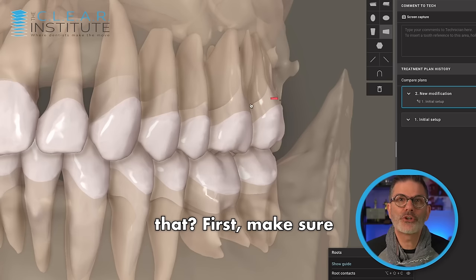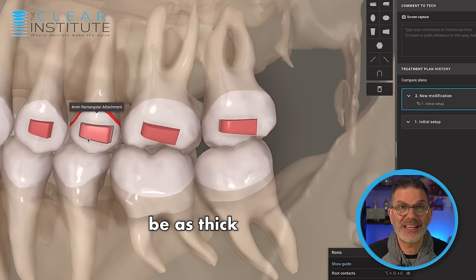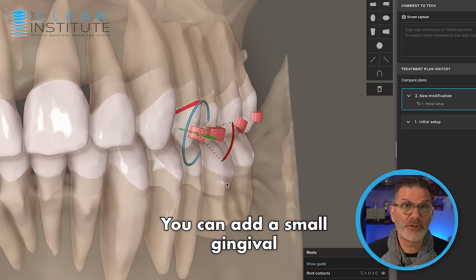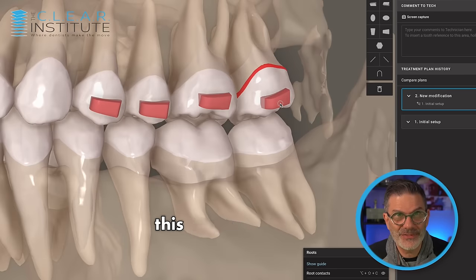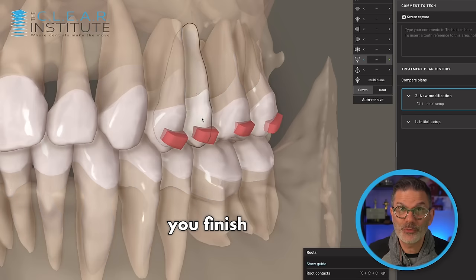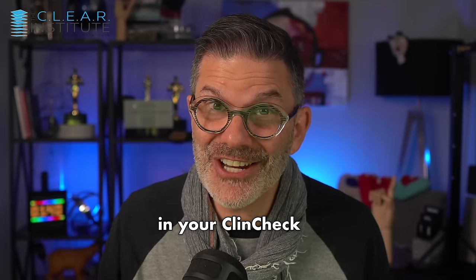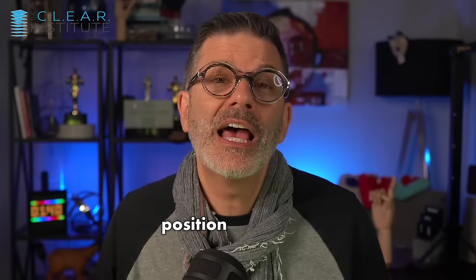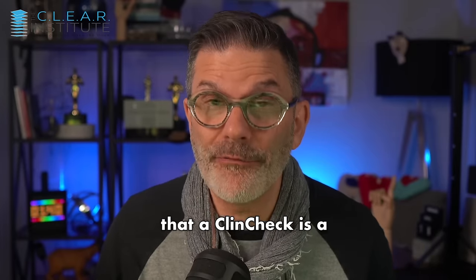How can we prevent that? First, make sure you add big rectangular horizontal attachments on the buccal of the teeth you want to expand. The attachments should be as thick as possible — thickness is very important because this is what will bring the resistance. You can add a small gingival bevel to help keep the tooth in tracking. And finally, the key tip: adding 5 degrees of buccal root torque for every millimeter of expansion will help you finish with the desired position. But this means that your teeth will look tipped lingually in your ClinCheck — it's counterintuitive. You will want to see the final stage with a perfect position, but remember that a ClinCheck is a force system.